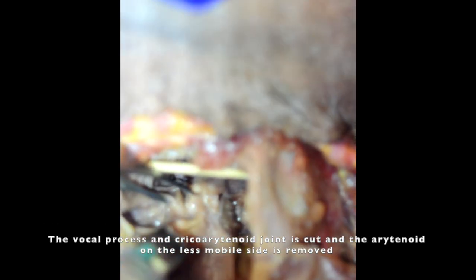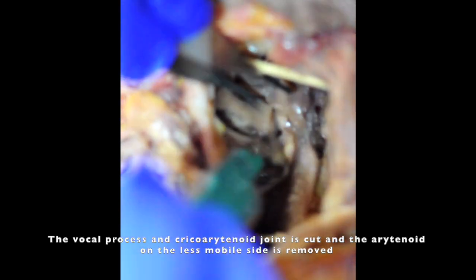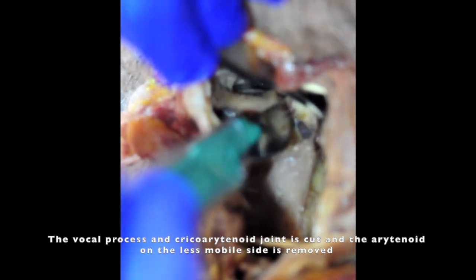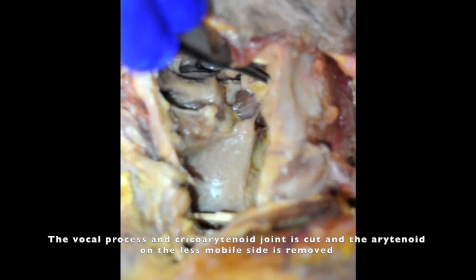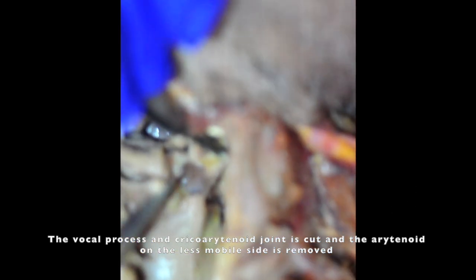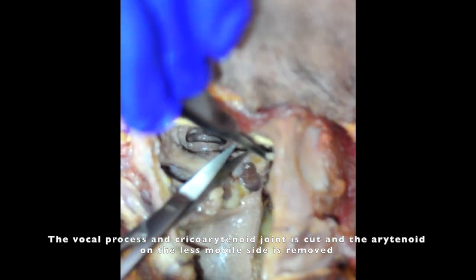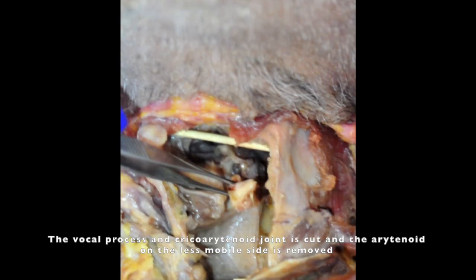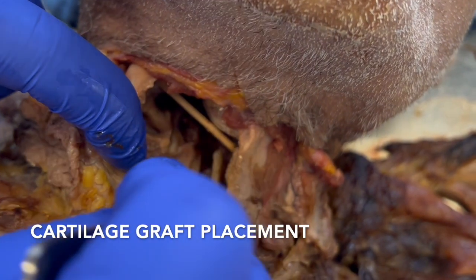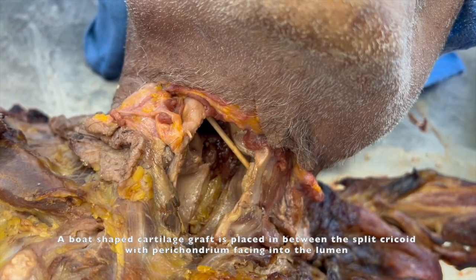The arytenoid is removed using an Allis forceps and scissors so that only the cartilage portion is removed. A complete arytenoidectomy is performed. This frees up the piriform sinus and arytenoid mucosa for the mucosal flap, which is then rotated downward to cover the costal cartilage graft.